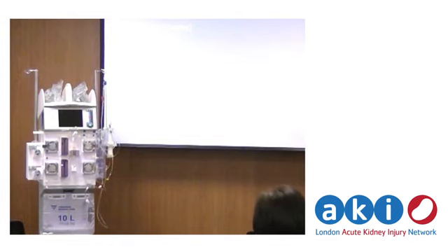And the scales are extremely sensitive, the resolution is 1 gram, and that's very important because the machine is trying to do what you've asked it to do in terms of the rates of the pumps, but the scales are being monitored, so it's constantly monitoring that the weight loss from the clean fluid scales and the gain on the waste fluid scale matches what you've asked for.